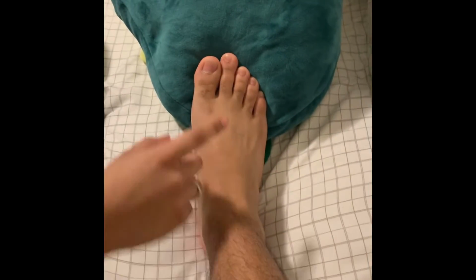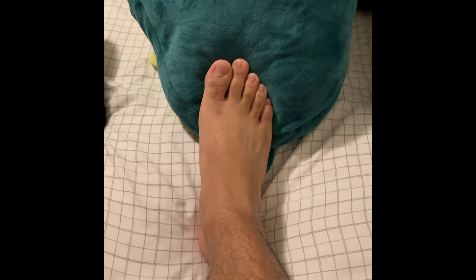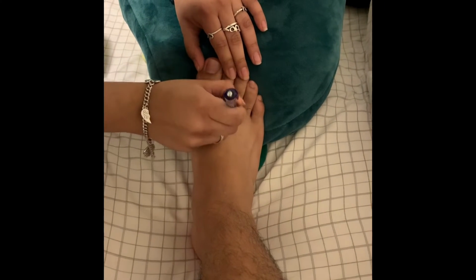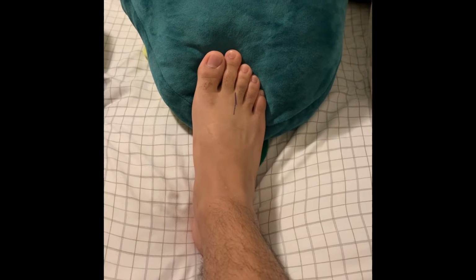We're going to do the central ray that's coming up from the machine. And it's going to be right here. And I'm going to mark your foot with the pen, okay? So we want it to be here in the middle like that. Be quiet. Then that's our AP projection.